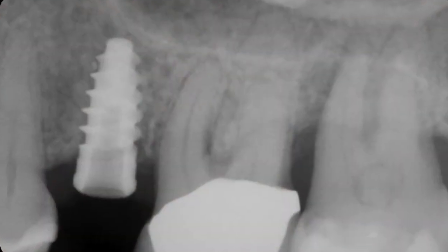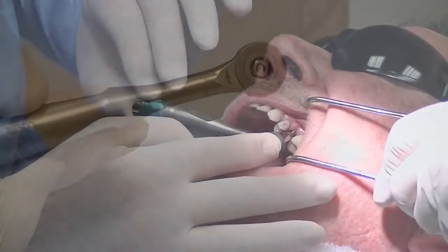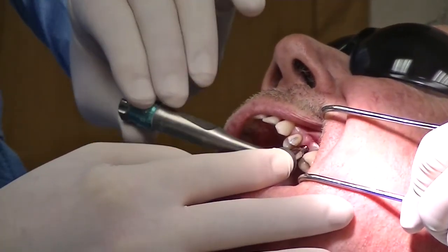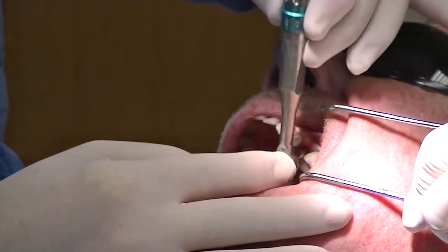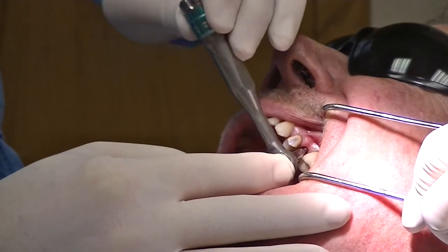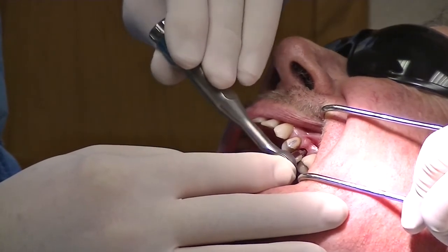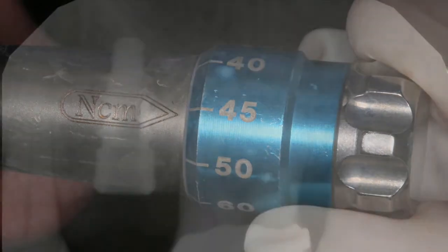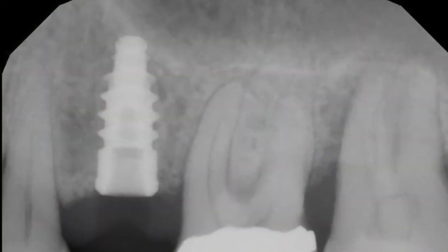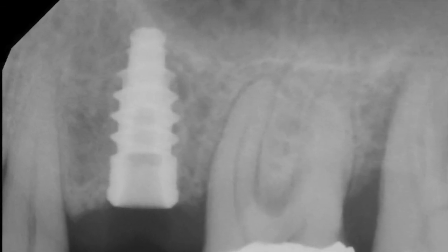Now we're going to take our torque wrench and determine the amount of torque we have in this situation. Here it's set at 25 newton centimeters. About one complete 360-degree rotation, or four quarter turns, we're going to get about a millimeter in depth — this allows really nice control and positioning of the implant. We ended up at 45 newton centimeters, which is pretty amazing. You can see my position of my dental implant is right at the crest, right at the floor of the sinus. We may have elevated that sinus floor slightly.